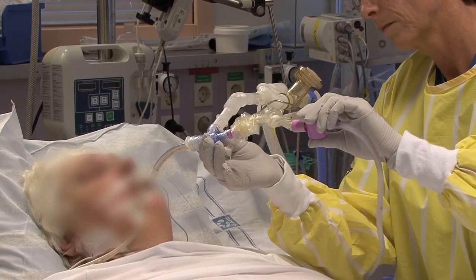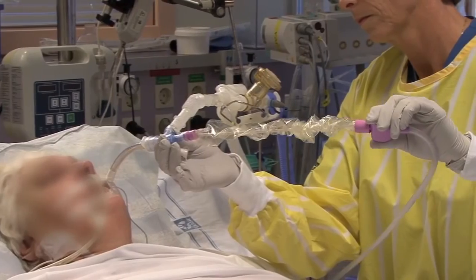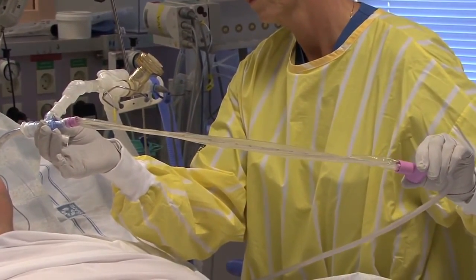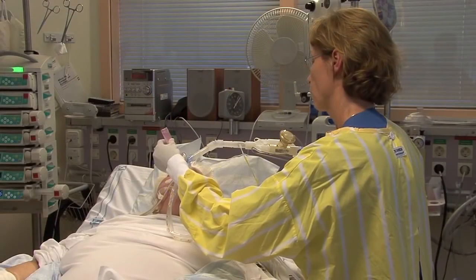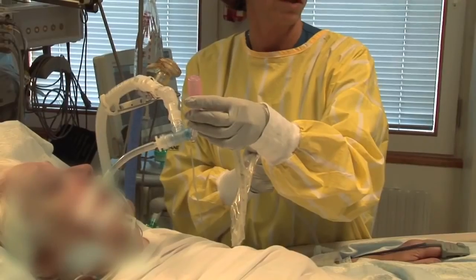Practitioners are encouraged to proceed cautiously when using closed suction and generally there is no need to rush the procedure. The actual suction time should be no longer than 15 seconds. But because the patient is still receiving ventilation, catheter insertion and withdrawal does not need to be rushed.